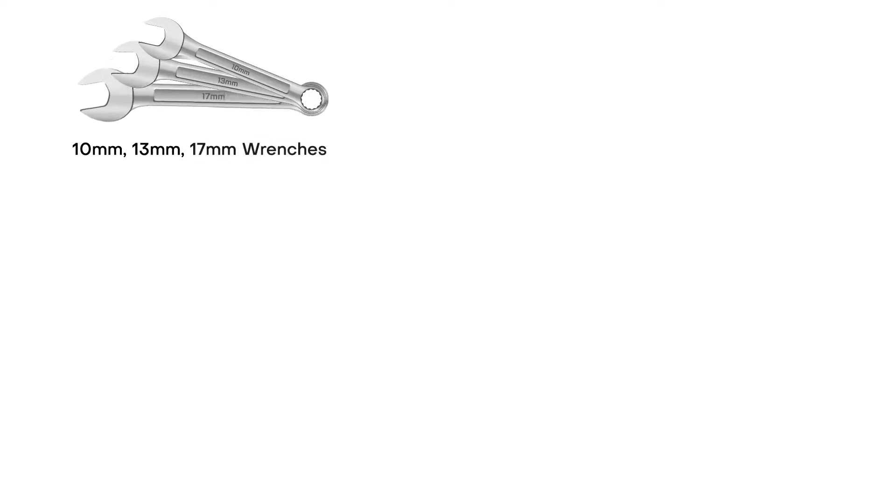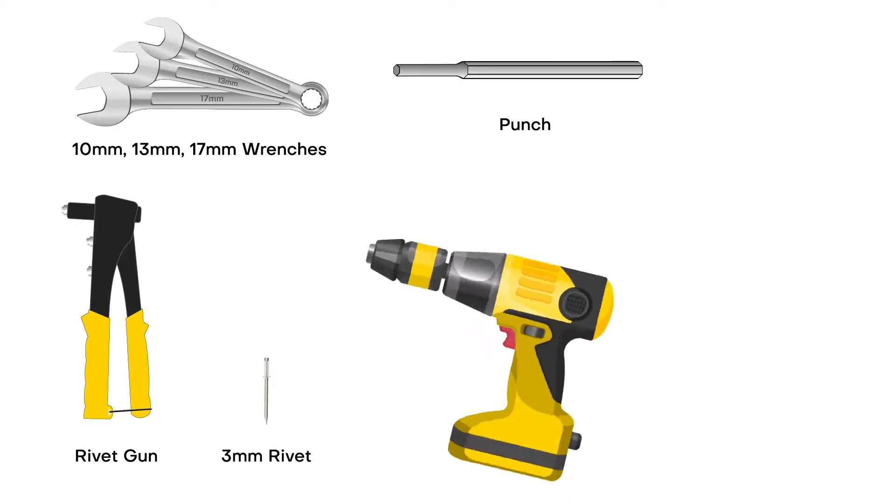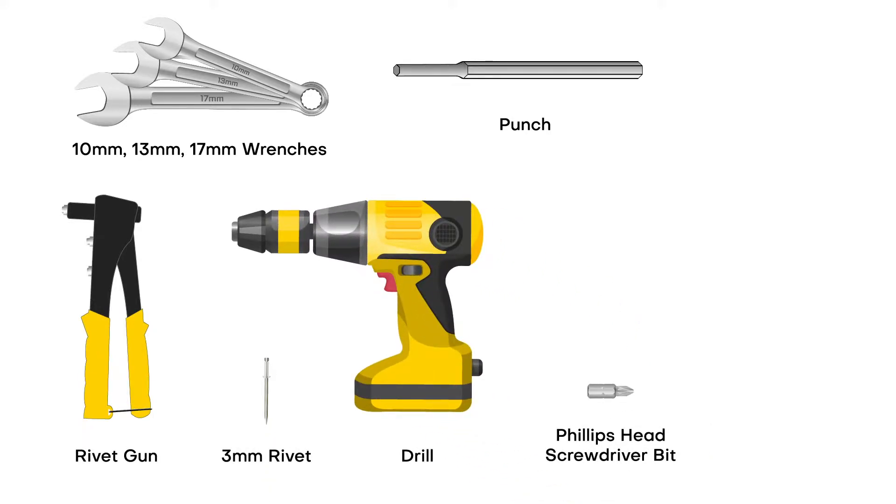For this task, you will need a 10mm wrench, a 13mm wrench, a 17mm wrench, a punch, a rivet gun, a rivet, a drill, a Phillips head screwdriver bit, a 1/8th inch drill bit, a 5mm hex wrench, and a hammer.